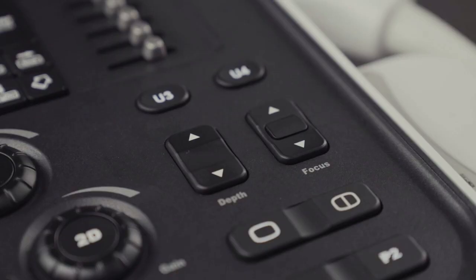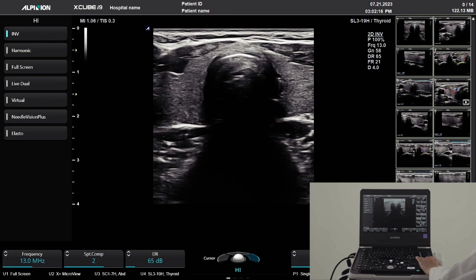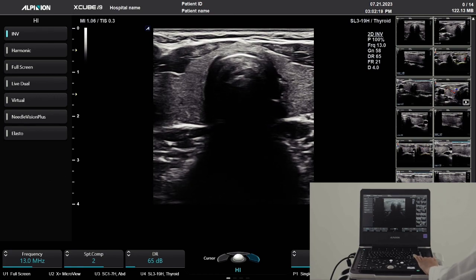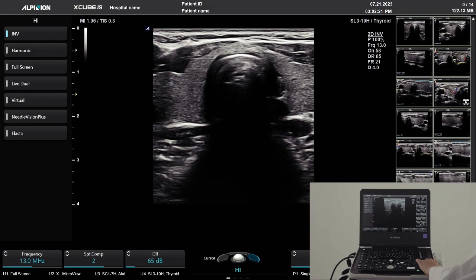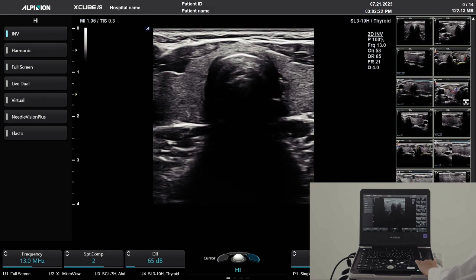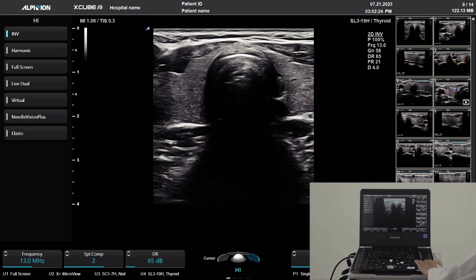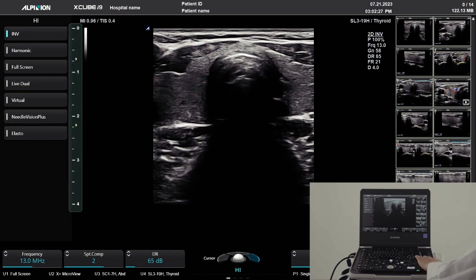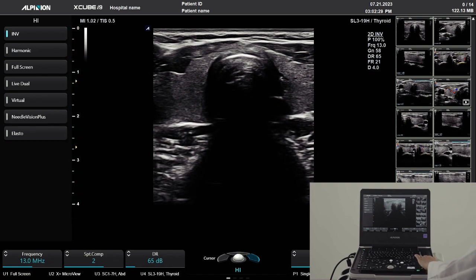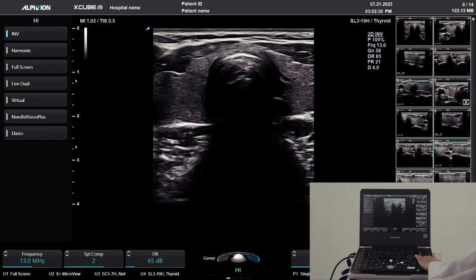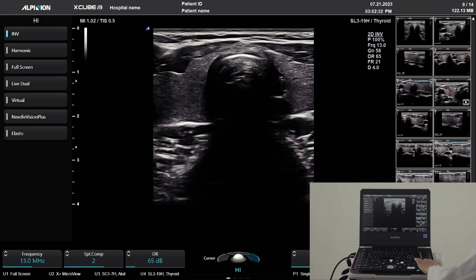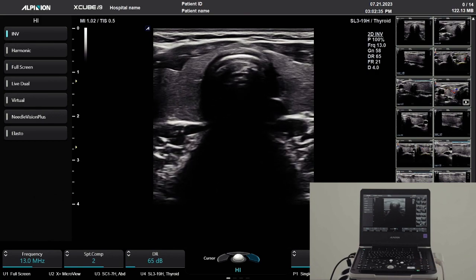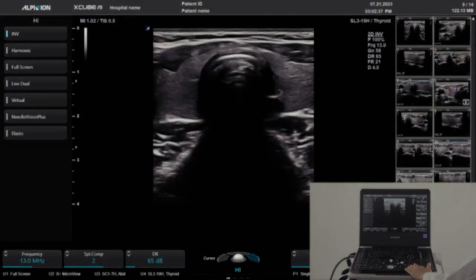Focus key: press the up arrow to move the focal point into the near field. The center button allows you to change the number of focal zones being used. Press the center button, then use the up/down toggle to change the number of focus zones. Press the center button again to set the focus and move the zones up or down.